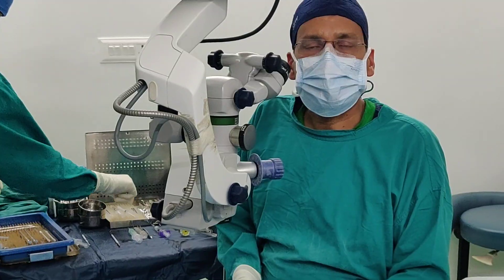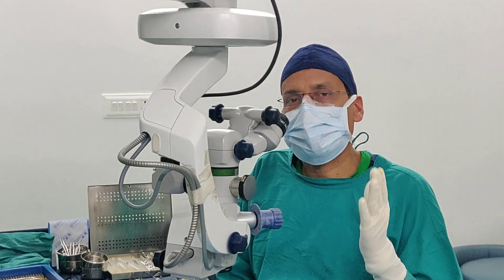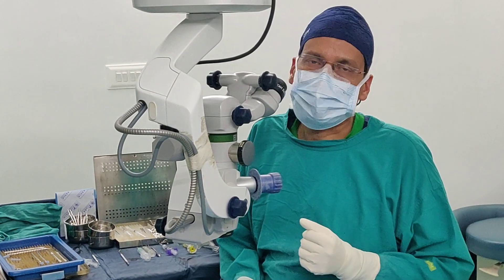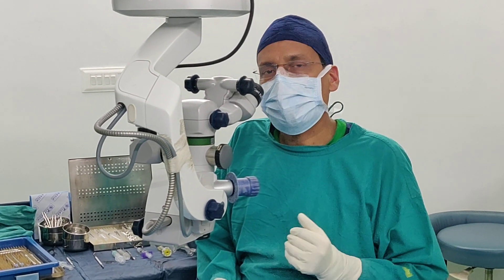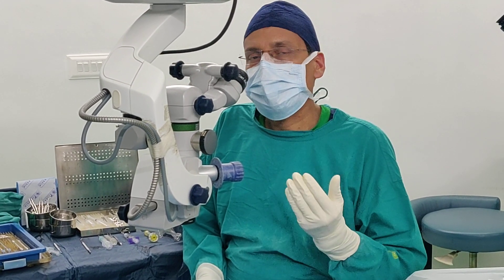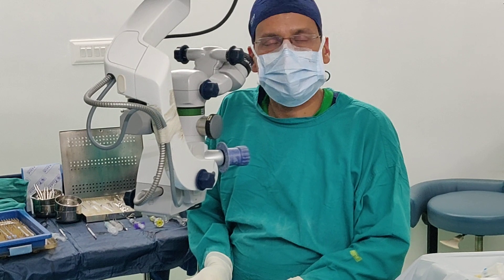Friends, you have seen cataract surgery with implantation of the Lucidis EDOF intraocular lens manufactured by Swiss Advanced Vision. This lens is one of the most exciting intraocular lenses in the field of ophthalmology — it provides excellent near vision and distance vision without any glare or halos. Thank you very much. Dr. Suresh Pandey, Surya Hospital Kota.